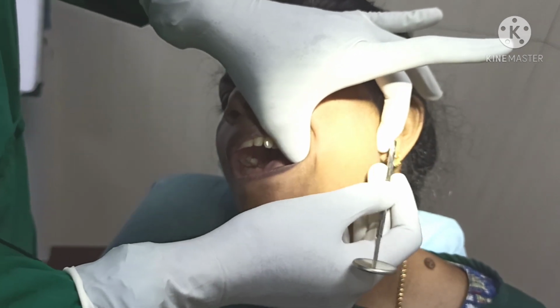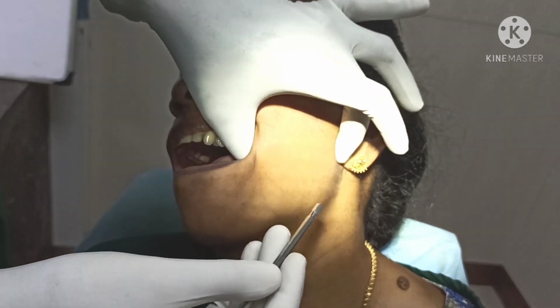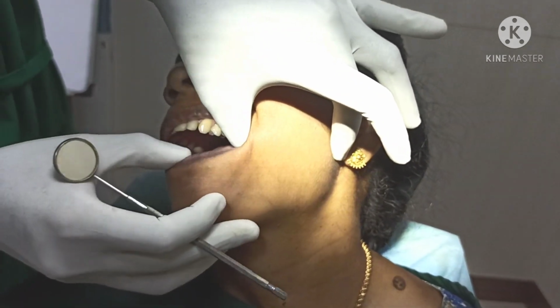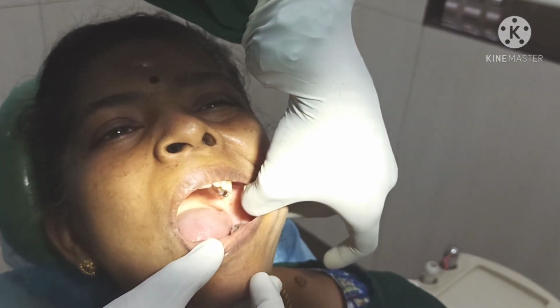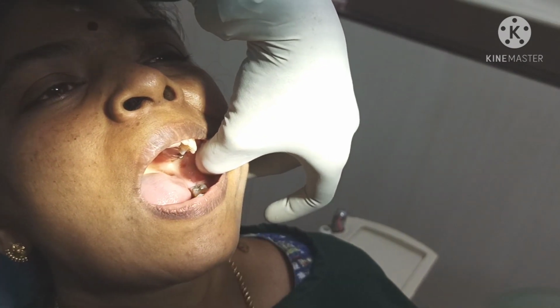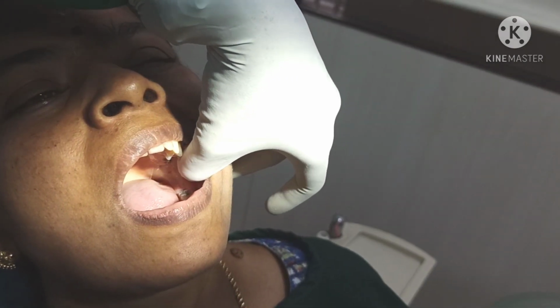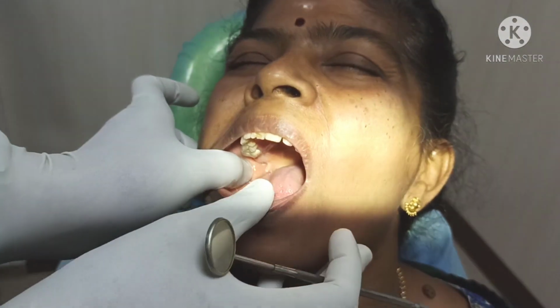We have to palpate the posterior border with this middle finger, and palpate the anterior border with this thumb. I am discussing the left side. For the right side it will be different. For the right side, I will palpate like this, the thumb palpating the anterior border and the middle finger palpating the posterior border.